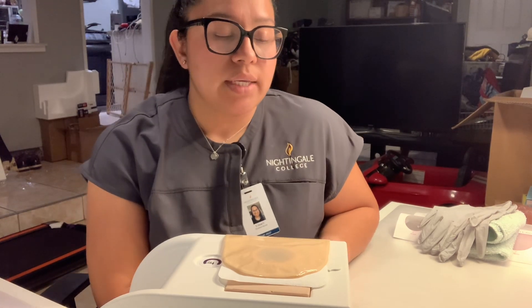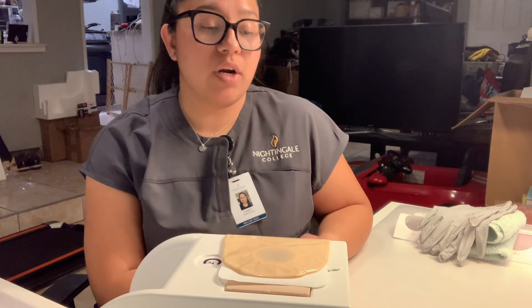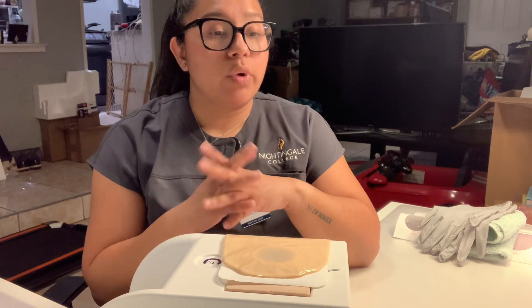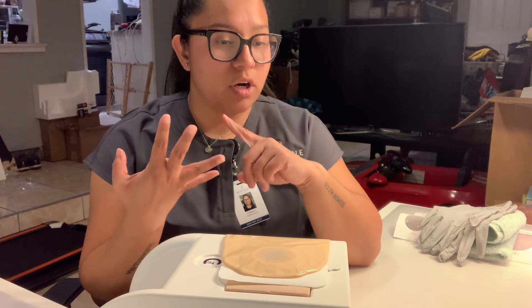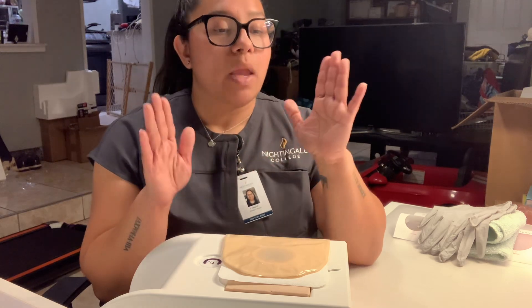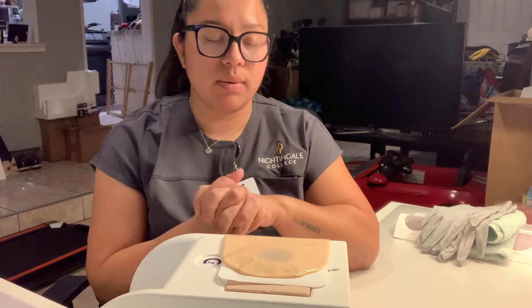Hi, my name is Crystal. Can I see your wristband please? And can you please give me your full name, last name, and your date of birth? Perfect. Thank you, Mr. Conde. Like I said, my name is Crystal and I'm here today because I'm going to provide some colostomy care. I'm going to remove your old colostomy bag along with your plate. I would clean your area, make sure that I'm assessing your area as well. I would put in a new plate and a new colostomy bag for you. Is that okay? Do you have any questions for me before we start?